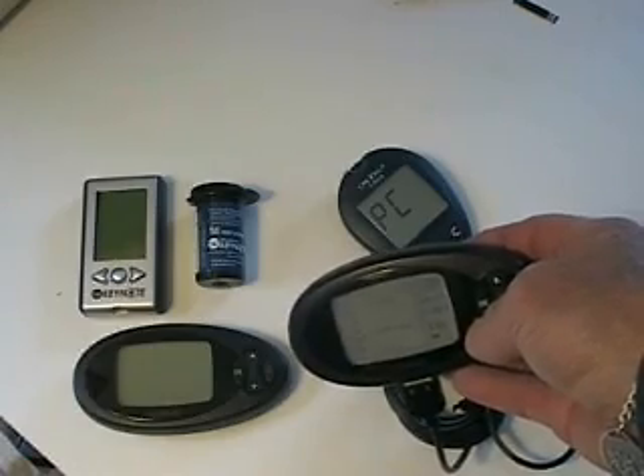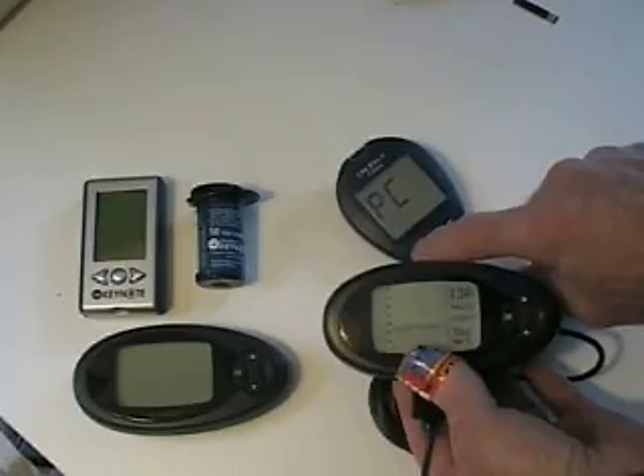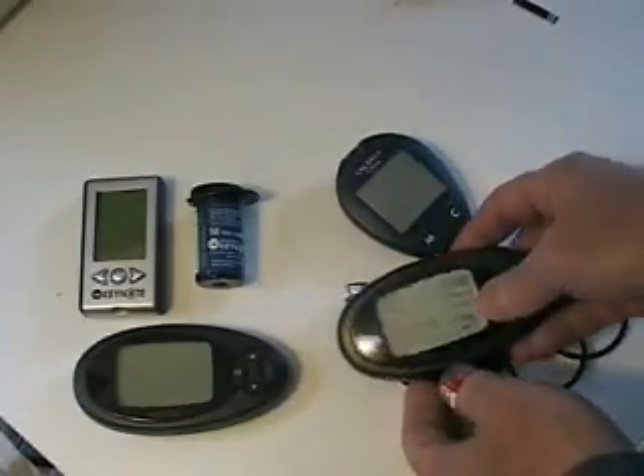When the graph comes up there, it's about 16 seconds later and now it's calibrated, taking the reading from the OneTouch Ultra. It shows the one-hour graph.